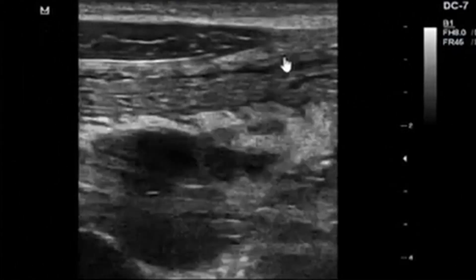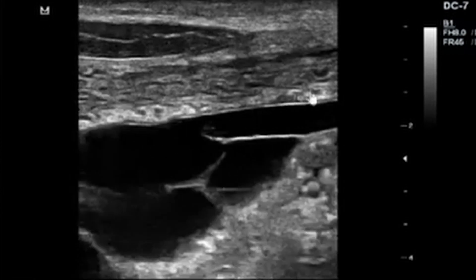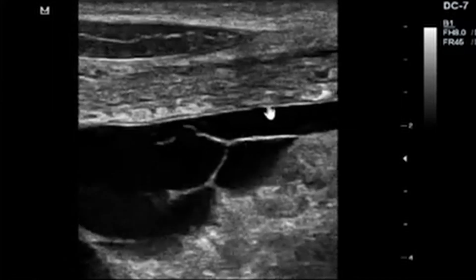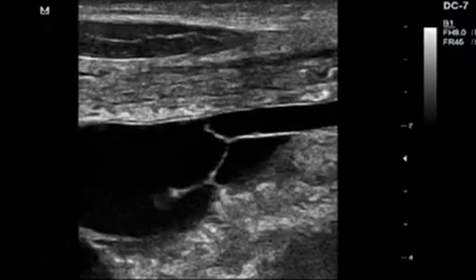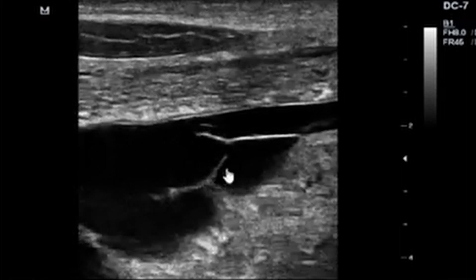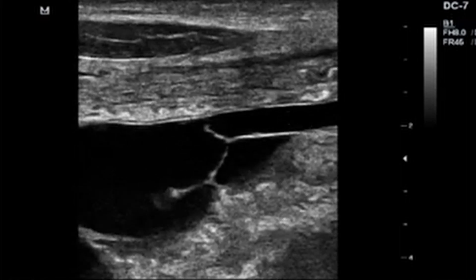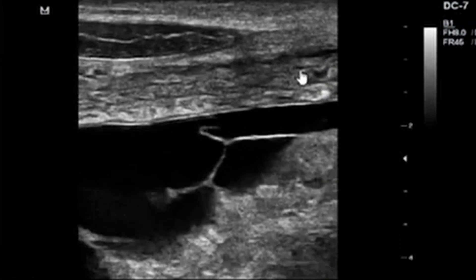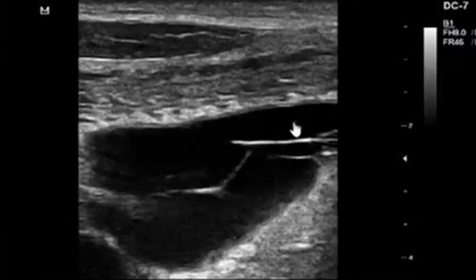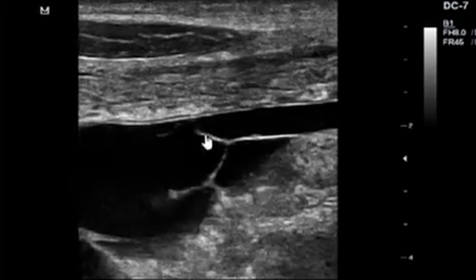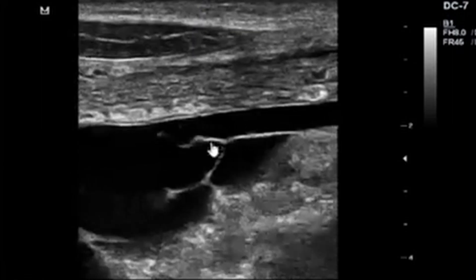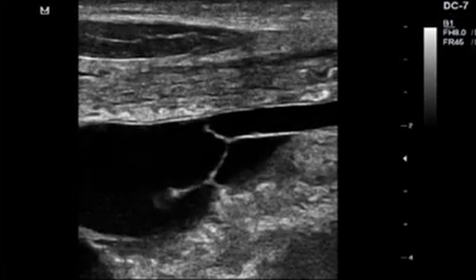In the peritoneal space, I saw this cystic collection with septations that you can appreciate. This could be some kind of a cyst or possibly some kind of hemorrhage in the peritoneal space. It is very difficult to make a conclusion from the sonographic finding alone. These are flaps of tissue that are more echogenic and actually floating within this collection.